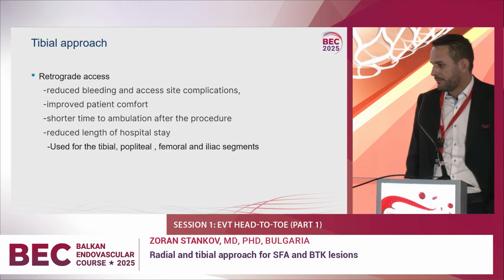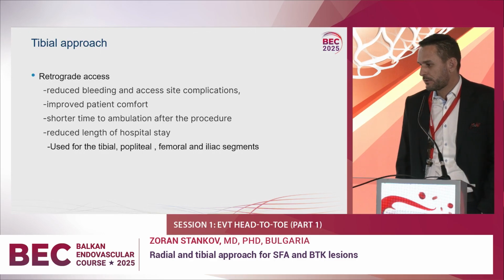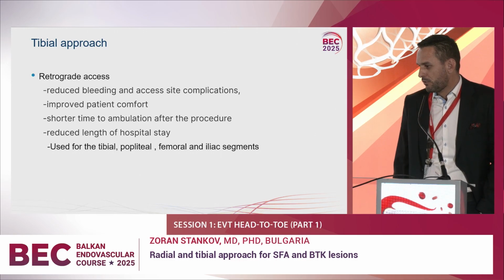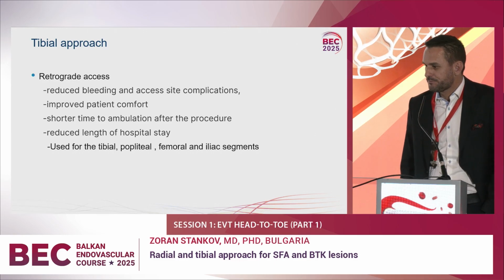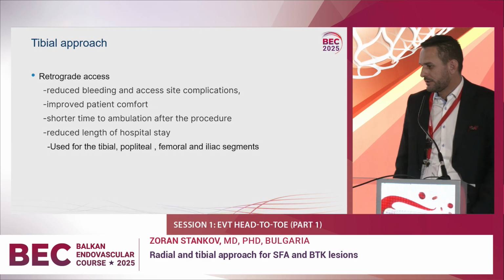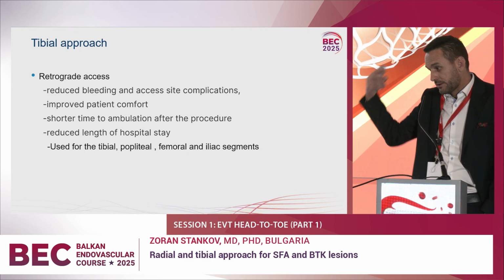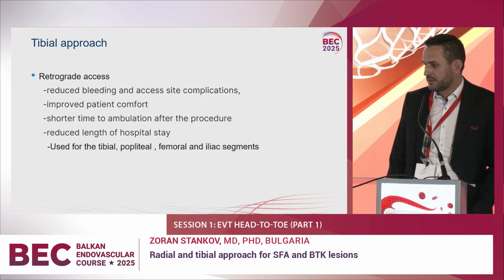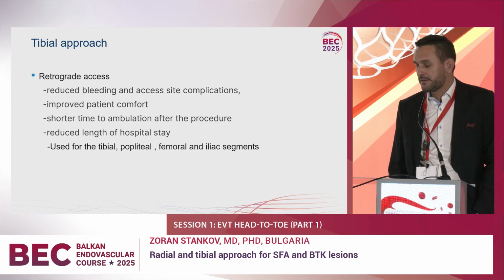Tibial approach is always used for retrograde access. It reduces bleeding and access site complications and improves patient comfort. There is a short time to ambulation after the procedure and reduced length of hospital stay. It can be used for the tibial, popliteal, femoral, and iliac segments.